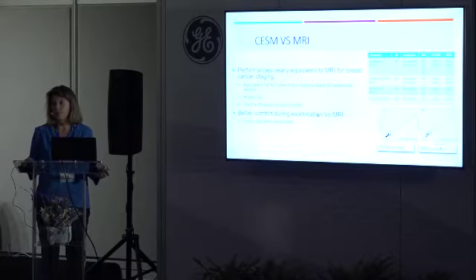And now when we ask patients what they think and feel during this examination, especially if they have had both MRI and contrast mammography, in this paper they evaluated quality and feedback for patients. Finally, patients prefer contrast mammography versus MRI because it's a faster examination, only 10 minutes maximum, and the longest part is to perfuse the patient. It's also less noisy and less anxiety-provoking. And when we compare tumor size with histology, in contrast mammography and in MRI, it's about the same for the index lesion and additional lesions. So this could also be used for breast cancer staging, for example.